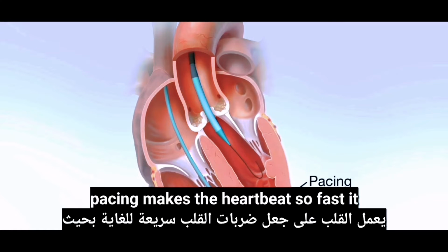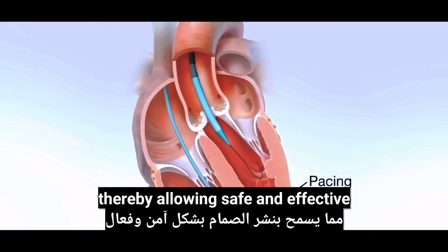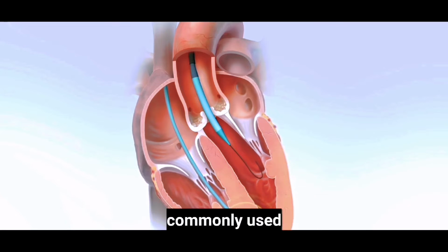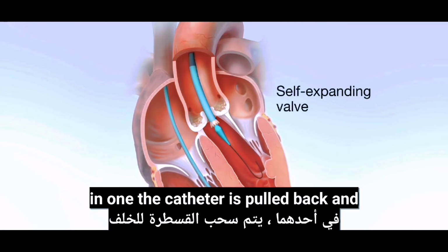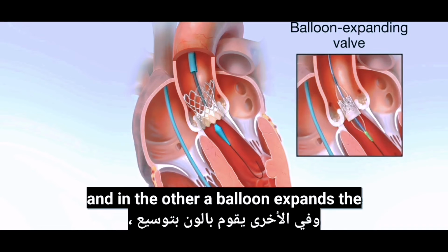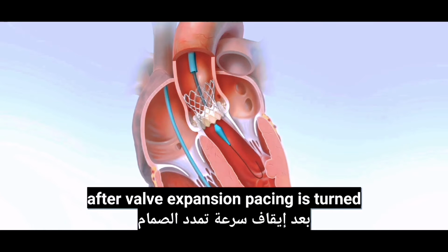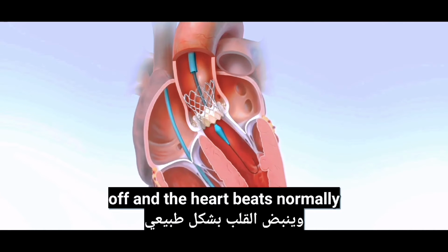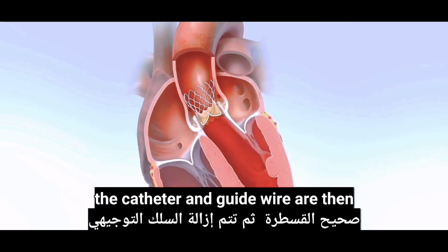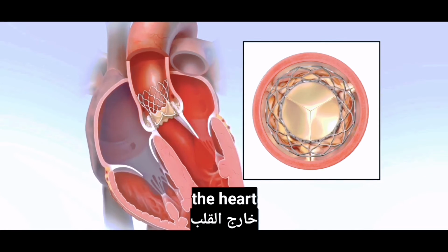Pacing makes the heart beat so fast it cannot pump blood for a few seconds, thereby allowing safe and effective valve deployment. To deploy the valve, two techniques are commonly used. In one, the catheter is pulled back and the valve expands into place, and in the other, a balloon expands the valve. After valve expansion, pacing is turned off and the heart beats normally. With the new heart valve working properly, the catheter and guide wire are then removed, and blood flows freely out of the heart.